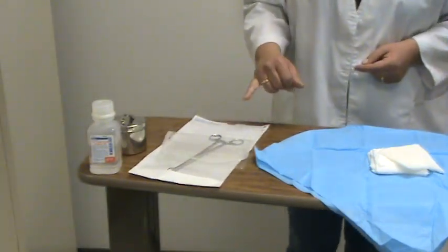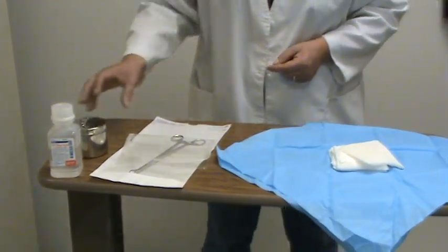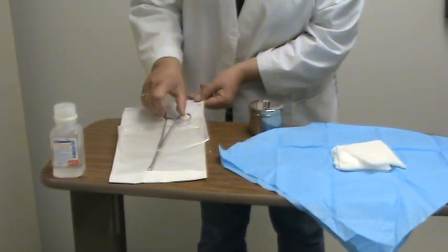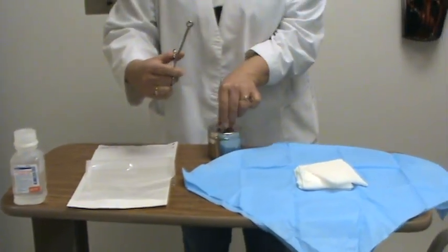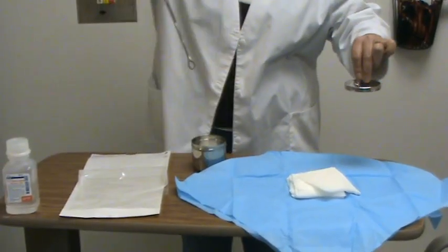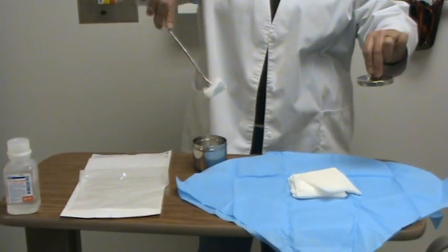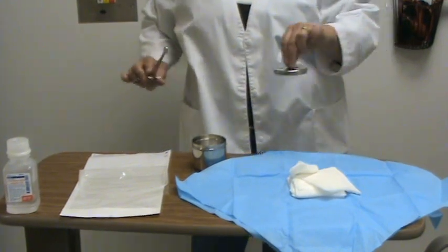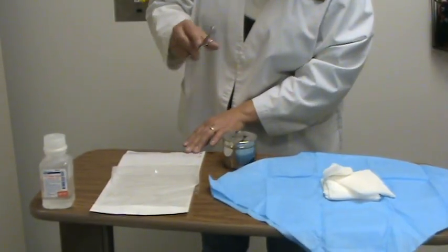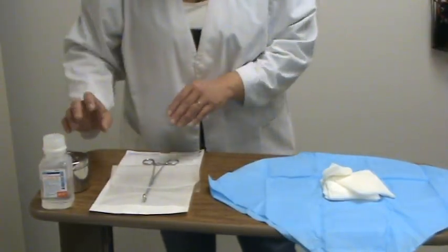All I have exposed of the forceps is where I'm going to be holding onto the handle, keeping the tips sterile. Bring it out, take the cover off — holding the cover down, not up. Hold the cover down. Go straight in, grab however many 2x2s you need, come straight out, go in from the side, drop and come back. Then put the forceps back in the package with sterile technique, sliding them underneath to make sure the tips stay sterile.